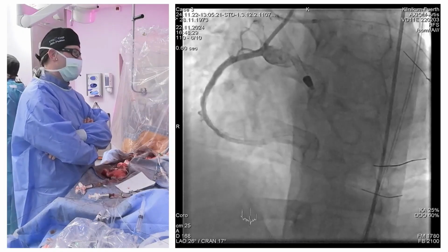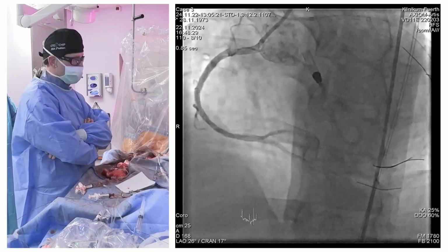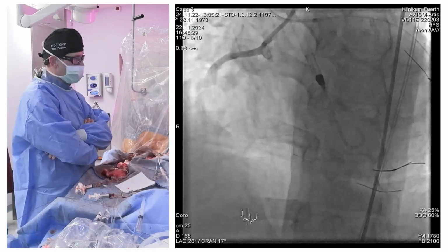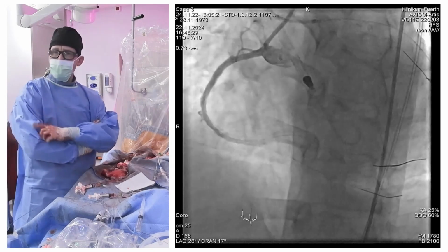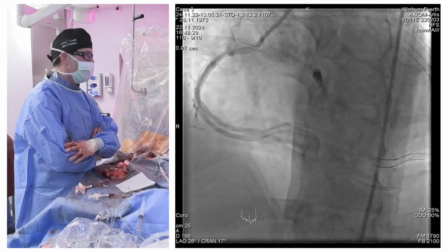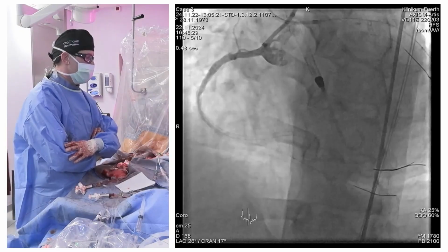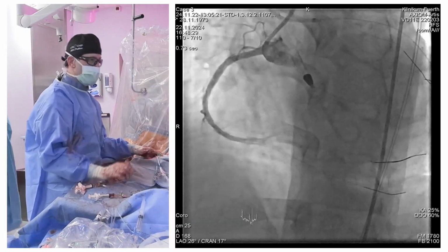Felix, may I ask you the question, because you know, and all CTO guys know that when patients come back, the arteries usually look much better, because now the endothelial function is depressed or practically no endothelium is there, and then in 6 weeks, 8 weeks, even in a couple of months, it's what we call restoration.